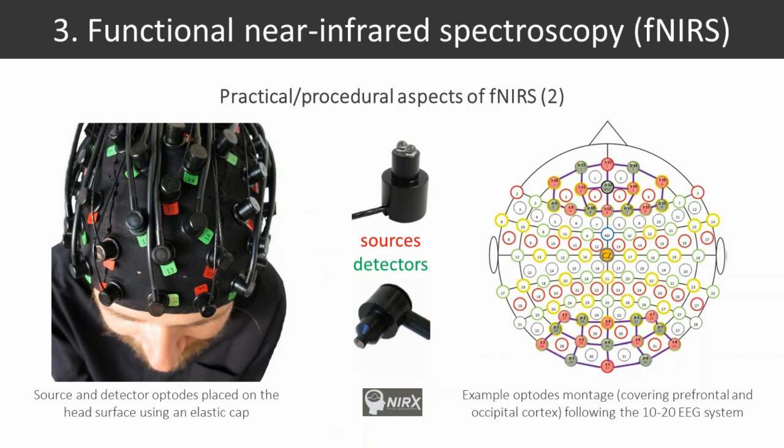What I would also like to mention is that there are several physical features that are beneficial for fNIRS, for example, features of fNIRS participants. So for example, bright skin and hair color, and also thin and fine hair, as well as a short distance from the head surface to the brain tissue, which we especially find in children, is positive, because then you can measure more brain tissue, and also the light is not so absorbed by non-cerebral tissue. So this is just one thing.